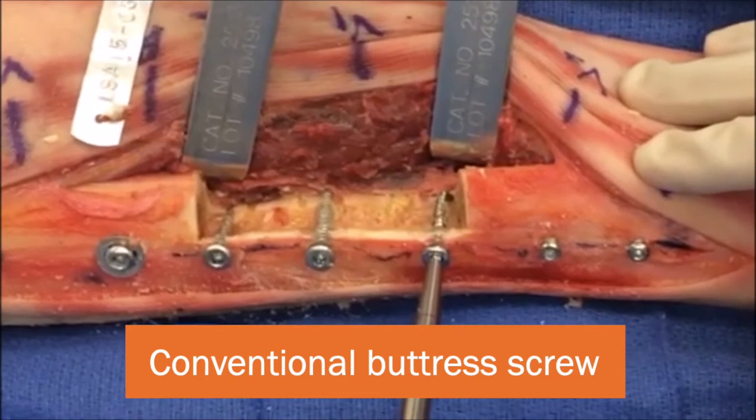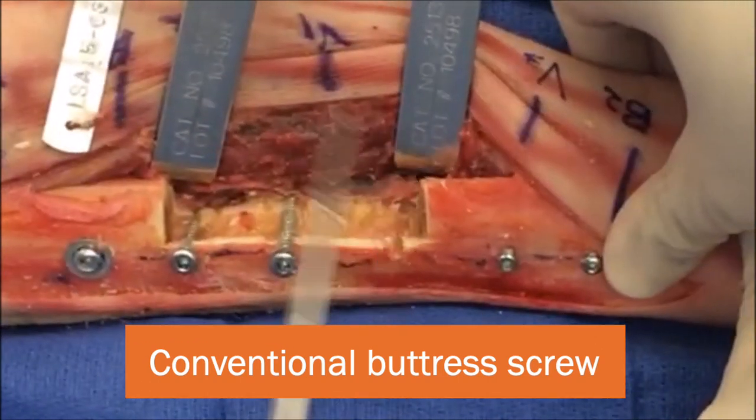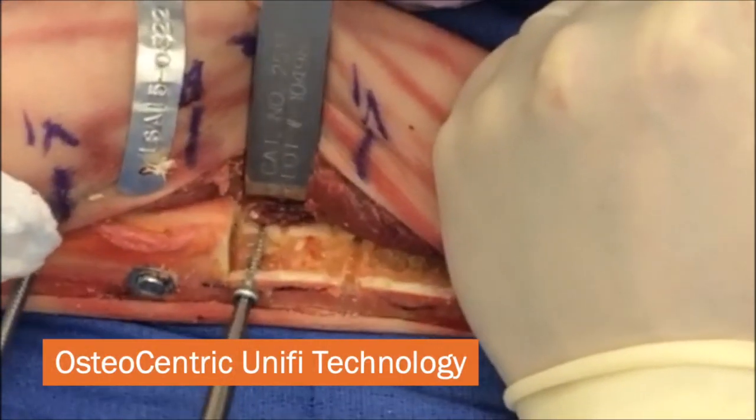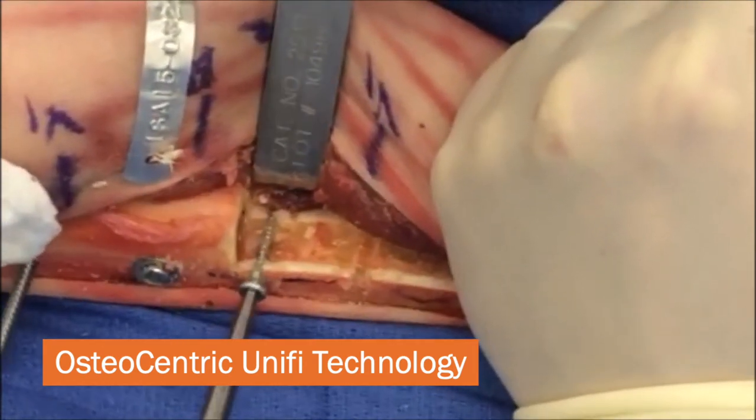This is a conventional buttress screw. I'm going to start wiggling around, and there is no resistance. The whole bone moves — the screw doesn't move.